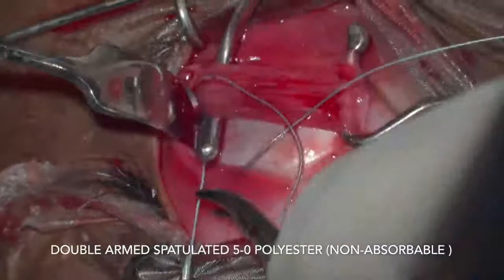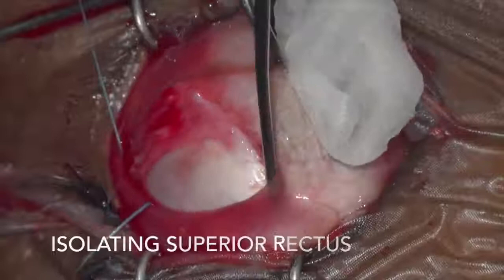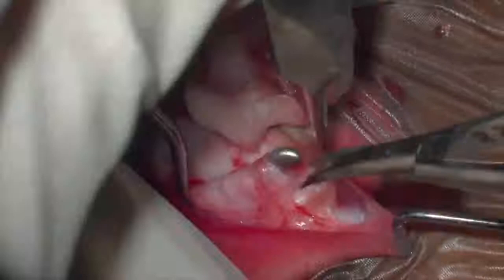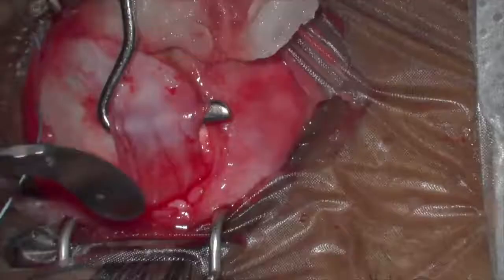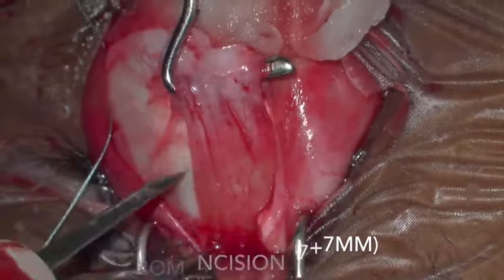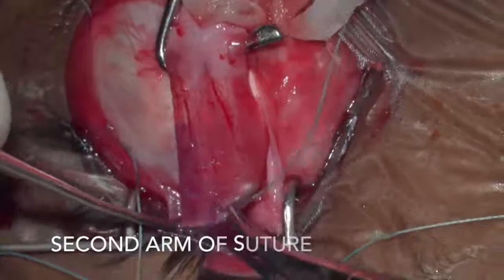The superior rectus is then isolated and cleared from the overlying fascia. 14 mm is marked, and the second arm of the suture is taken through the full thickness and half the width of the superior rectus.